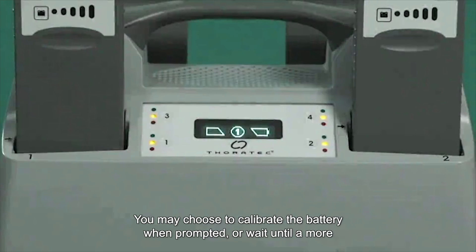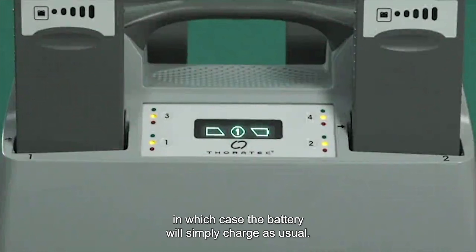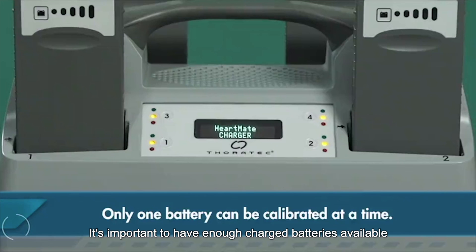You may choose to calibrate the battery when prompted or wait until a more convenient time, such as overnight, in which case the battery will simply charge as usual. Only one battery can be calibrated at a time, so it's important to have enough charged batteries available when planning for calibration.